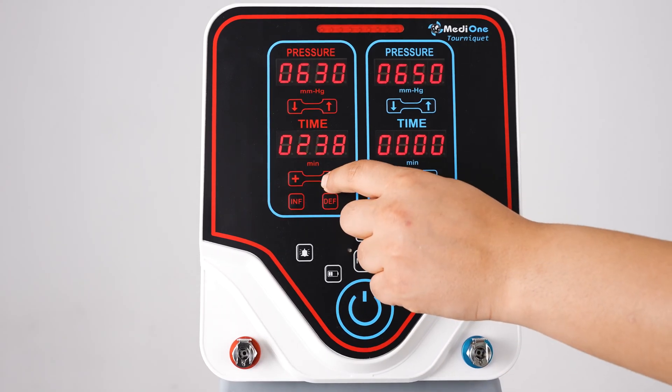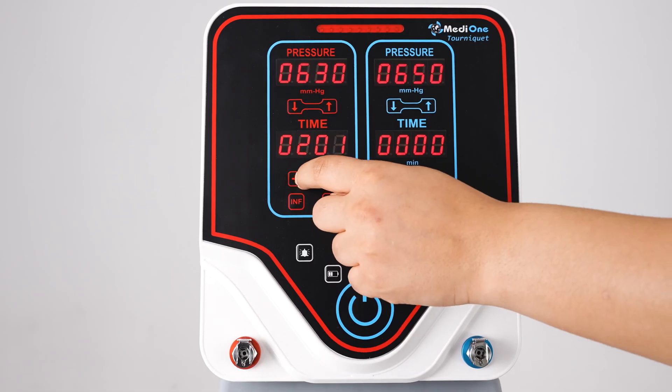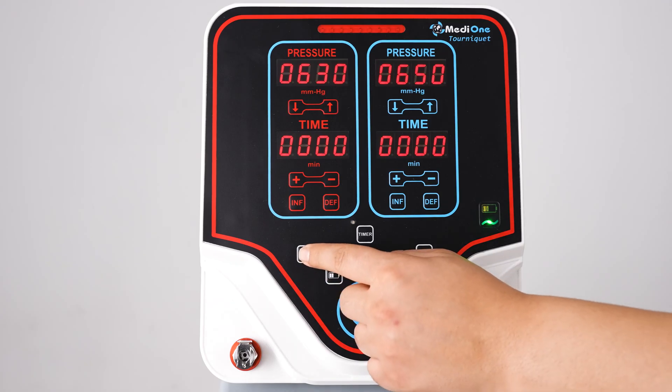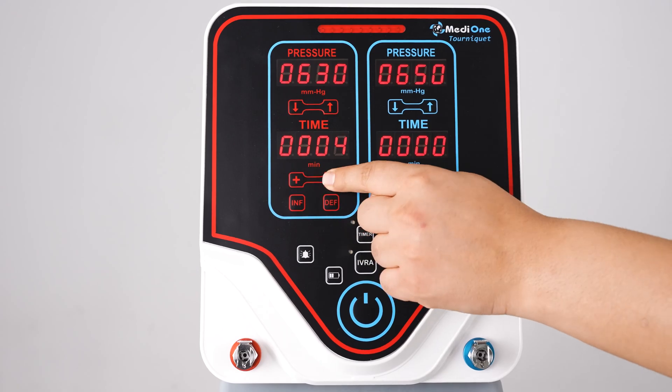There is a time indicator below the pressure gauge. The time interval can be set between 2 and 240 minutes. You can use the warning limit button to set the device to give a warning a specified number of minutes before the operation ends.